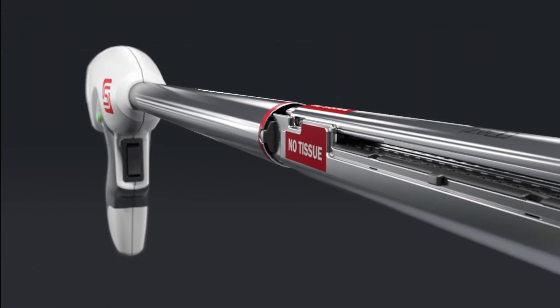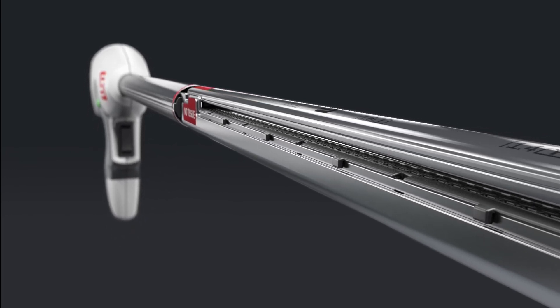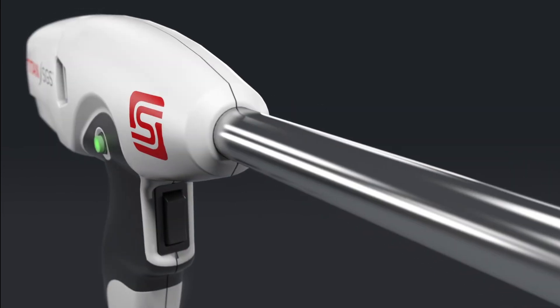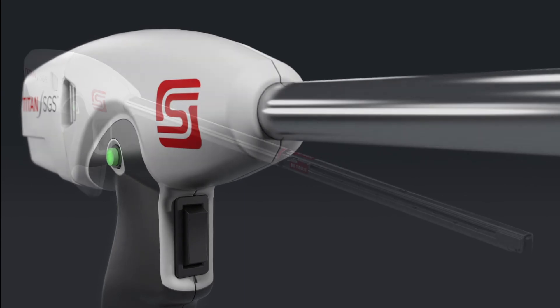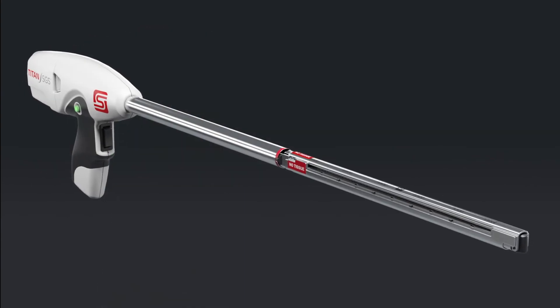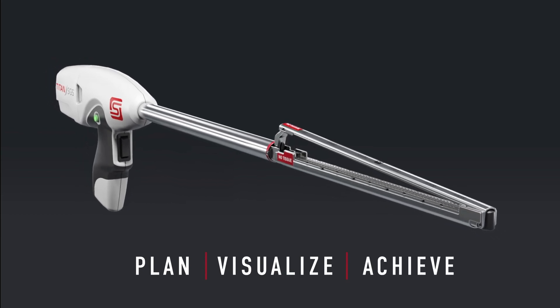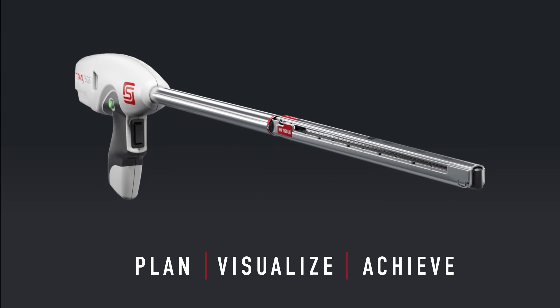With limited device technology, bariatric surgeons have been able to achieve the ideal tubular surgical sleeve anatomy less than 40% of the time, which can lead to inconsistent outcomes for patients. Now, with a combination of a repeatable technique and the purpose-built Titan SGS stapler technology, achieving a more consistent sleeve pouch anatomy is possible for your patient.